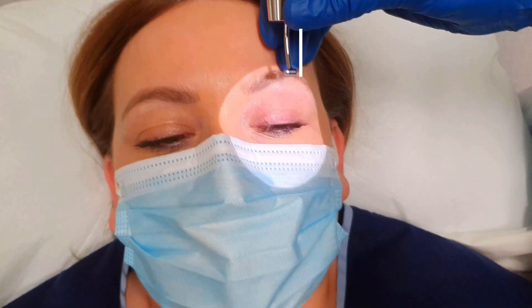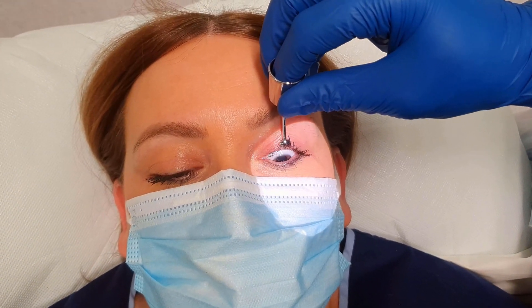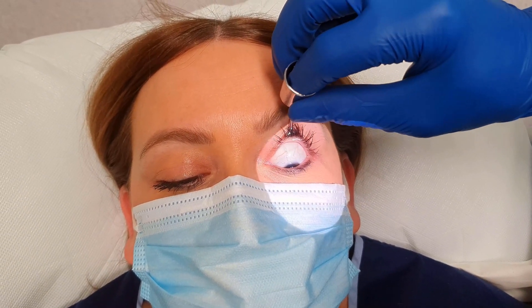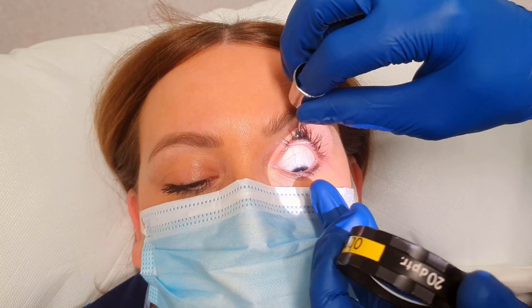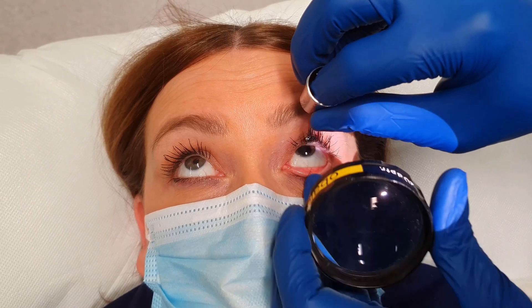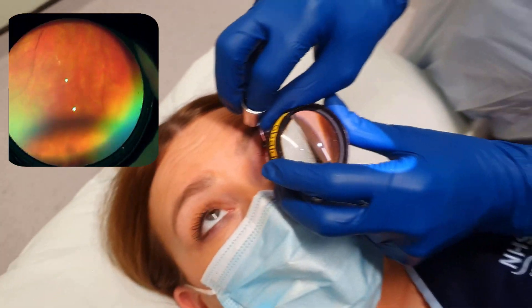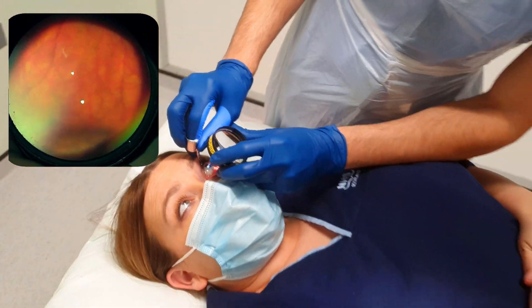This example shows the examination of the superior retina. The patient is asked to look downwards towards their feet. The indenter is then placed on the superior eyelid and rolled. Then the patient is asked to look upwards. Only a gentle pressure is required. This is a dynamic examination and the indenter will be moved to observe the peripheral retina.